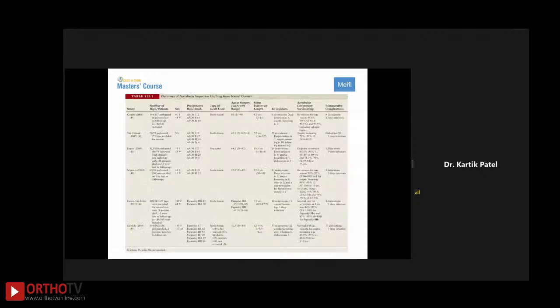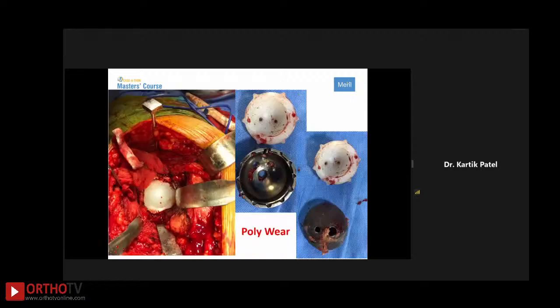And so I went through the literature and searched for what is the best basis for the defect, allograft or augments. Some centers show very good results with the allograft and some centers showed average results. And as the patient was of old age, I revised with this. Revised the cup, except the liner, it was a superior liner wear, and the cup was revised without any bone loss.